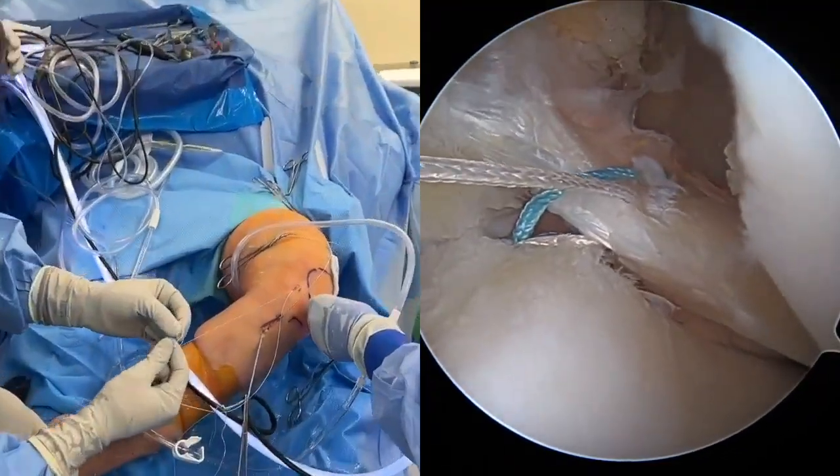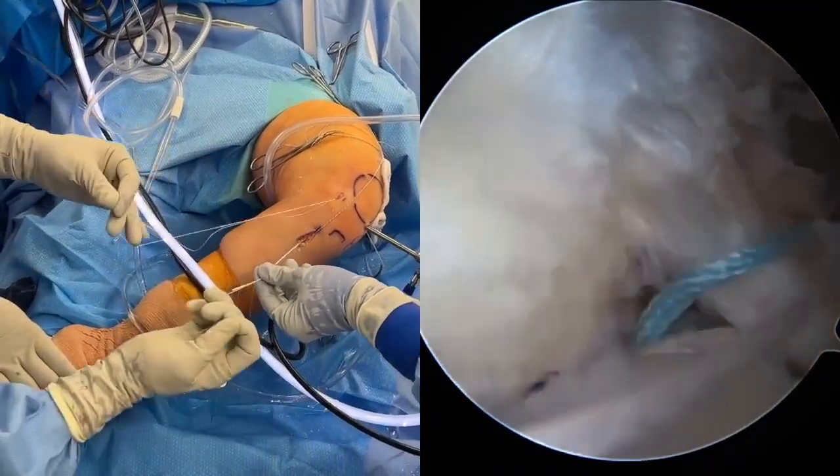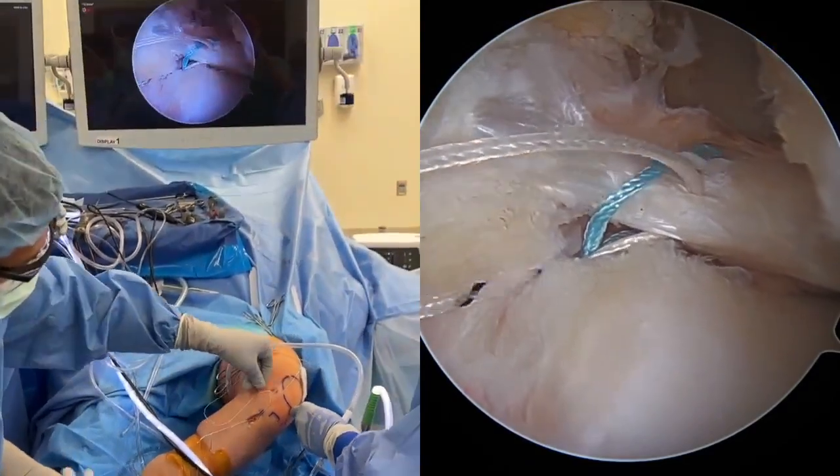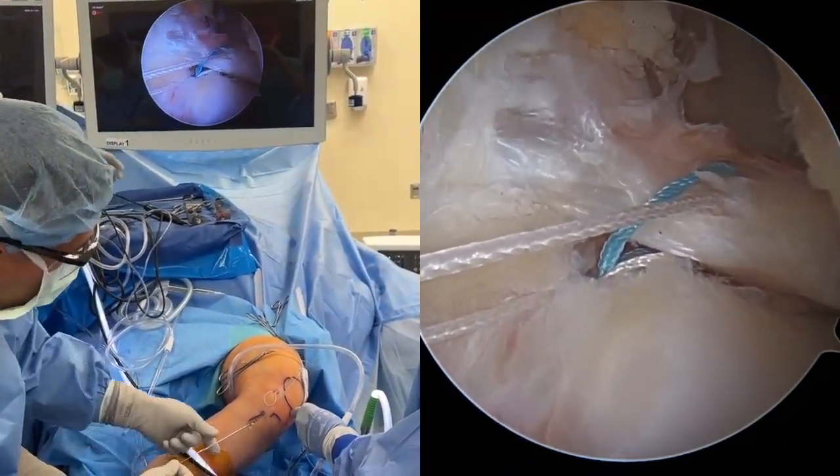The white repair suture is loaded through the loop of the white and black conversion suture and folded at the purple ink mark indicator. With the safety hemostat removed, the white and black conversion suture tail is used to shuttle the repair suture into the knotless mechanism.